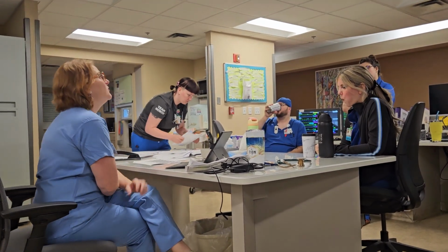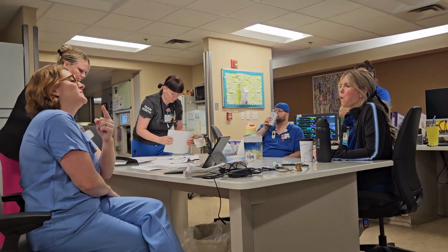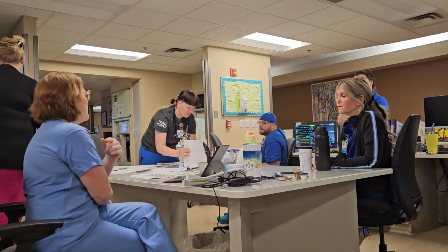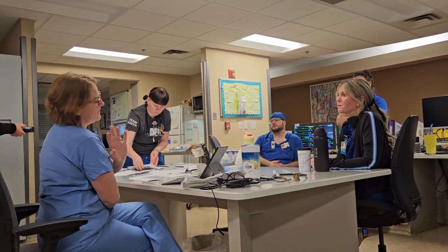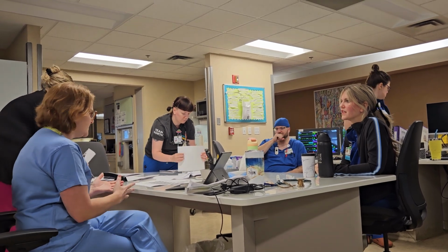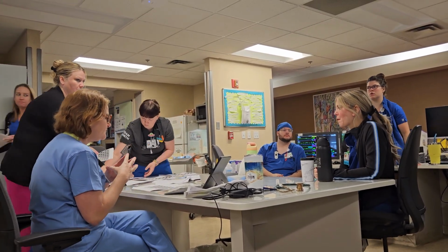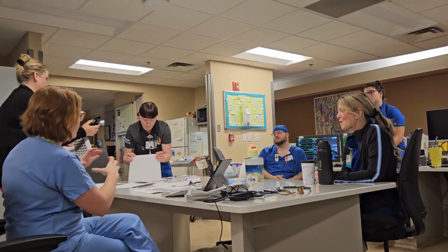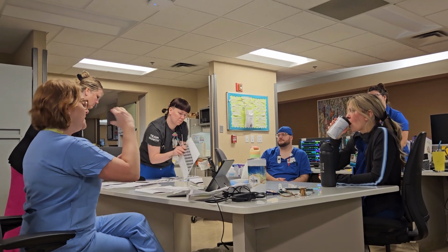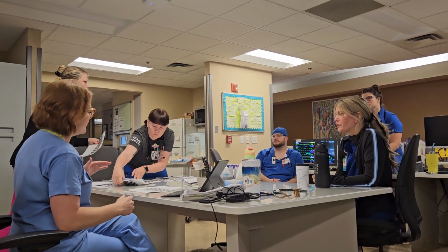So volume control is much more common. On these Hamilton vents, it's called APV-CMV, I think, right? Which is just their fancy nomenclature. It's essentially the same thing as assist control, volume control, continuous mandatory ventilation, where we set a tidal volume, the ventilator is going to give that tidal volume, and we set the rate and the tidal volume. What's going to adjust is the pressure at which we are delivering that breath.